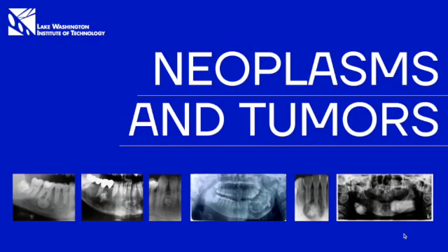Neoplasms and tumors. A neoplasm is an unregulated growth of tissue due to genetic change or mutation and can be classified as benign or malignant. A tumor is a raised lesion without fluid greater than 2 centimeters in diameter. Neoplasms may have varied appearance depending on their stage of development.